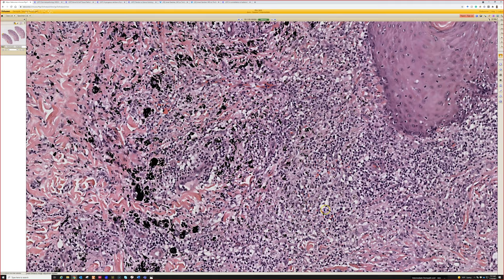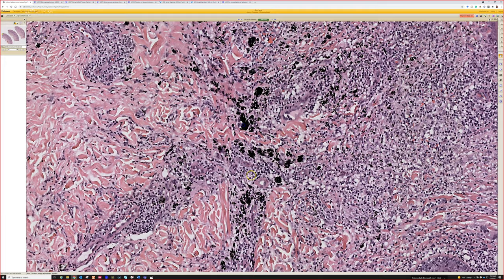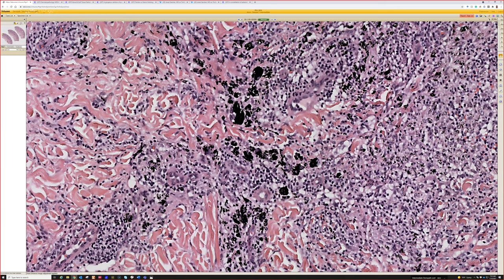This is not from the human body — and how do we know? It's black. The human body does not make anything that is black. No matter how black a nevus looks on the skin surface, microscopically it's always brown. Melanin pigment is brown, hemosiderin is golden brownish. The body can make red, yellow, green, brown — but never totally pure black. So if you see something in tissue that is black, that means almost certainly it came from outside the body.